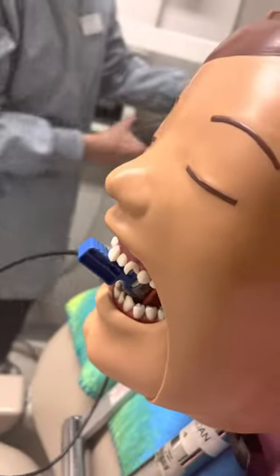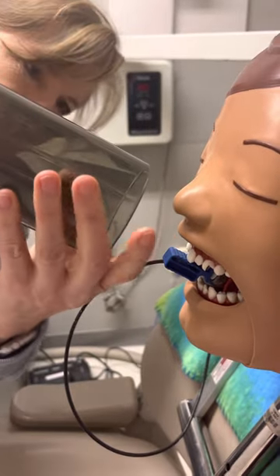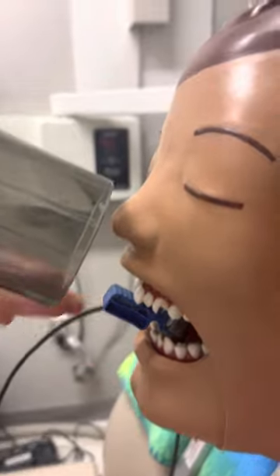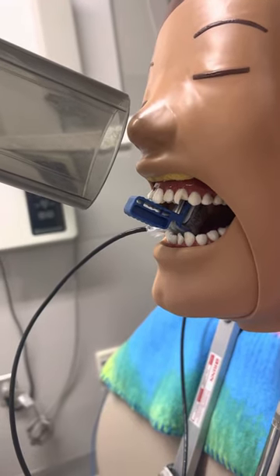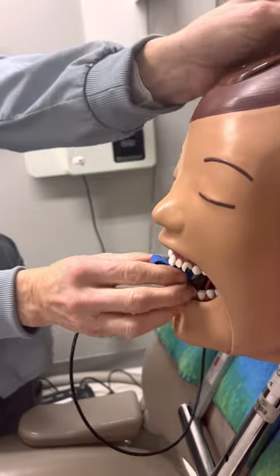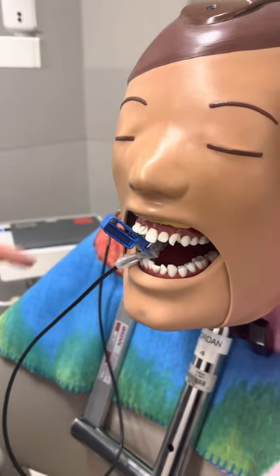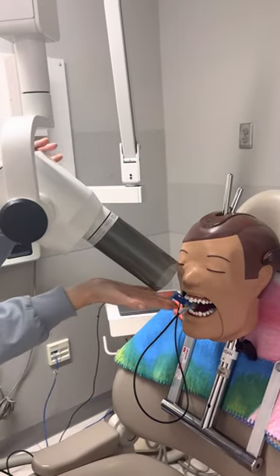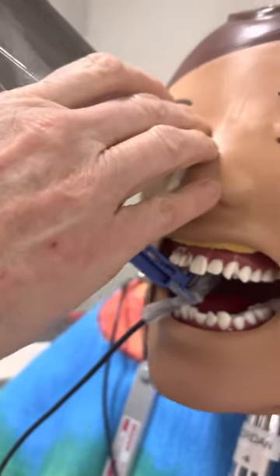Your cone is going to go at that same angulation as the sensor. You have to visualize that circle there. She's got her hand showing where the bottom of the sensor is, and you can see that her PID is in line with the sensor. That's your centrals. She's going to tip over to do the canine lateral — just like before. Your canine is your longer tooth, so it's going to have more angulation. She's going to adjust that PID to visualize that it's in line with the sensor.